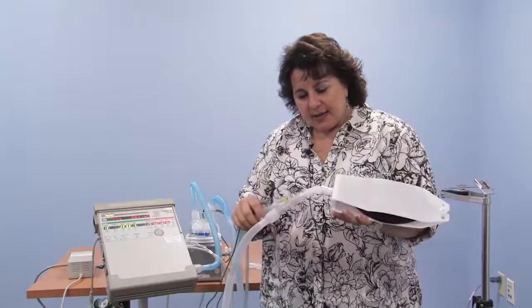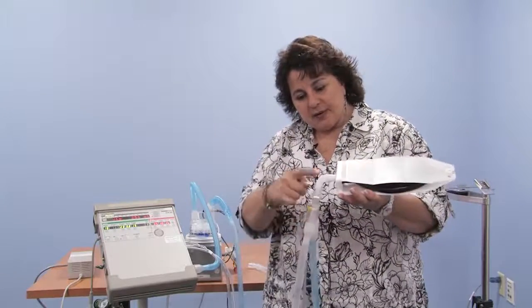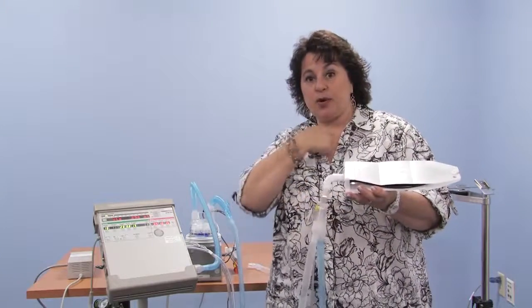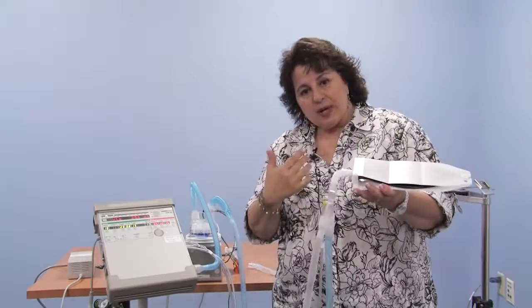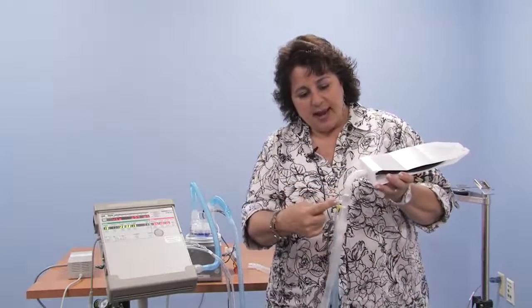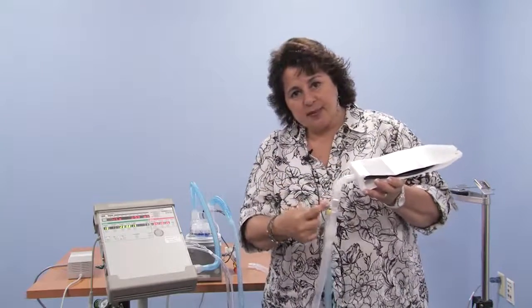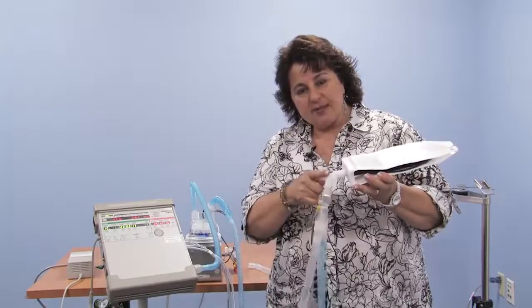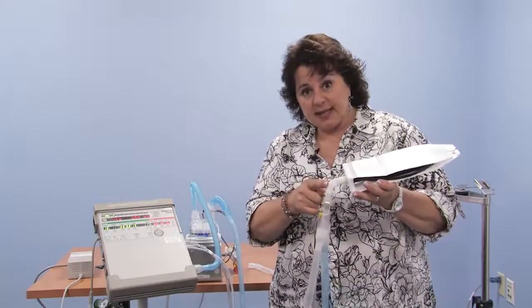You've noticed that I added a little piece to the end of our circuit here. This allows us to attach the ventilator to the tracheostomy tube rather than attaching at this point, which would be very difficult. What I need you to understand is that the fresh air is going round and round here. And the air that's within this adapter, your child has to rebreathe. So they breathe in, they blow out, but they have to rebreathe this air with carbon dioxide in it.